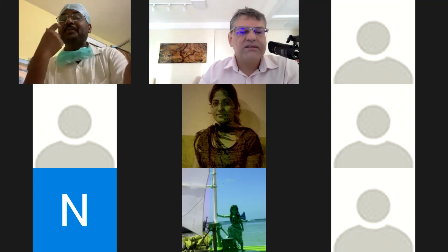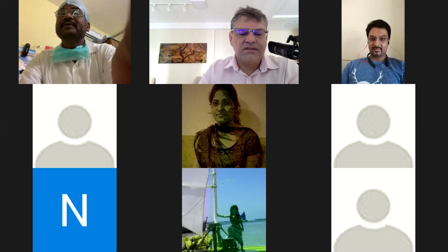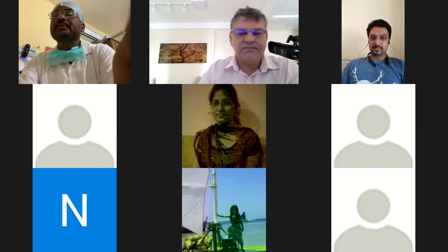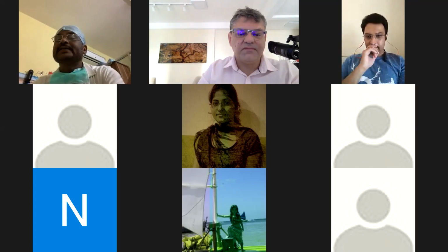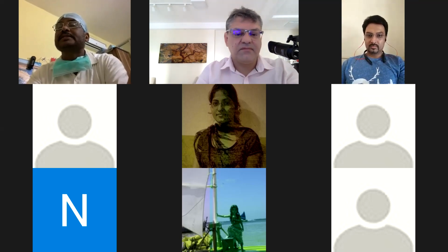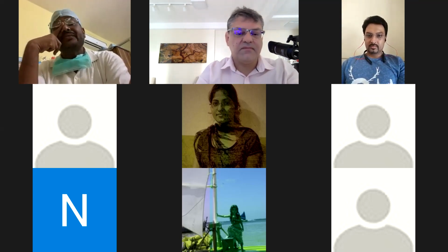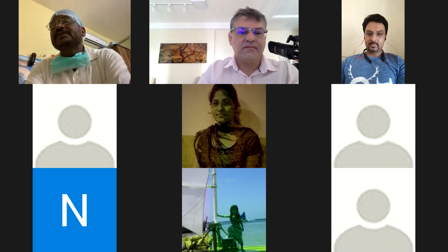Nice presentation by Pooja. Thank you. She told actually, but one thing I would say, this window defect is actually transmitted hyperfluorescence. Usually it happens because of any defect in the RPE. So RPE atrophy, which is actually the accentuation of the choroidal fluorescence. That is what you mean to say.